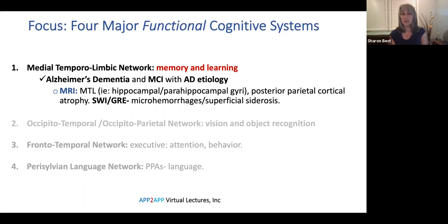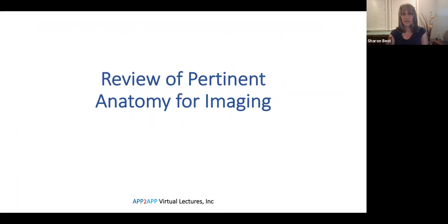We've already discussed how to separate Alzheimer's dementia — where the patient is dependent on someone else for finances, appointments, and medications — from MCI, where the patient is still able to do those things. That MRI would be expected to show medial-temporal-lobe atrophy in greater proportion and posterior parietal cortical atrophy. Also, on an MRI sequence called SWI or GRE, we may look for microhemorrhages or something called superficial siderosis.